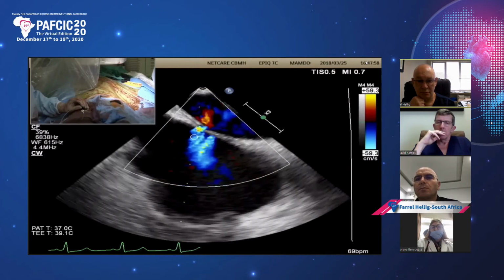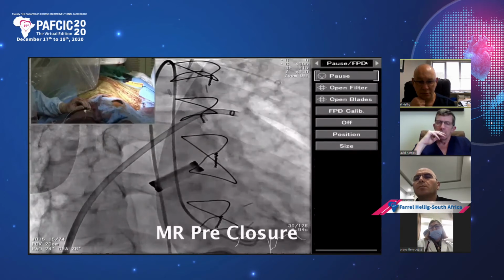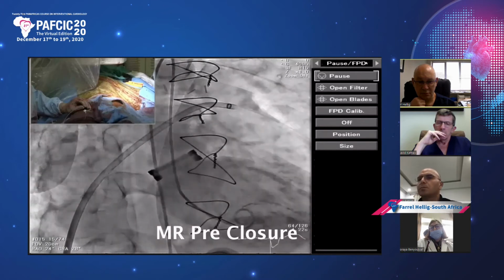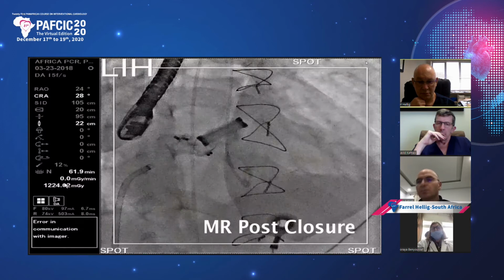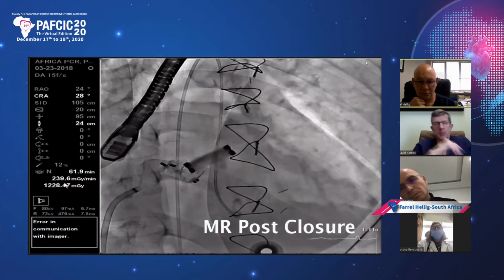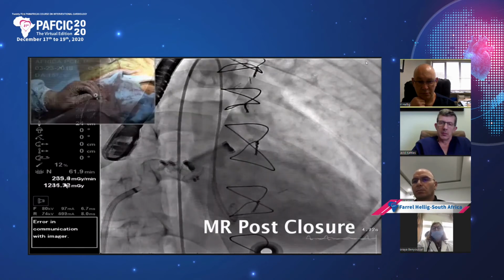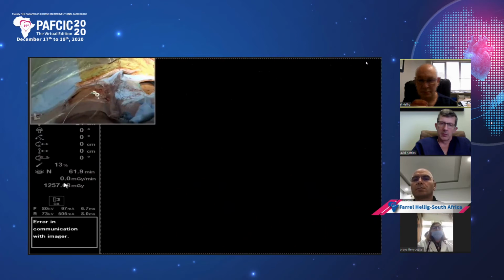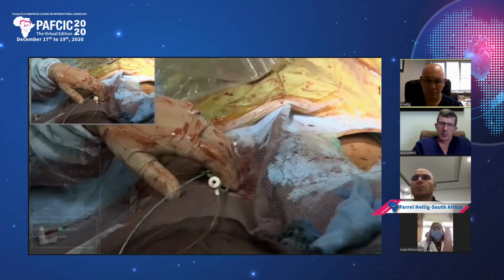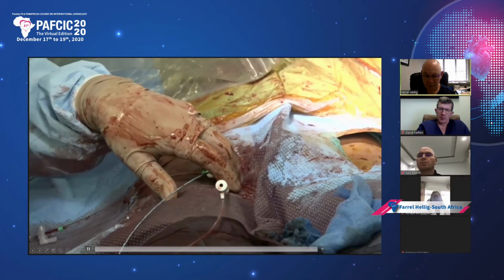You can see the ventriculogram from beforehand and the degree of MR, which I think is pretty dramatic. You can see the entire atrium. Now there's just a little puff of MR. It's quite okay. So I'm going to ask Shaheen to close up here, and I'm coming over to the room. Thank you very much to everybody. Thanks, Rob, for your support. Thanks to the team.